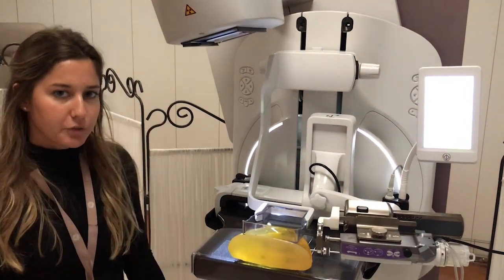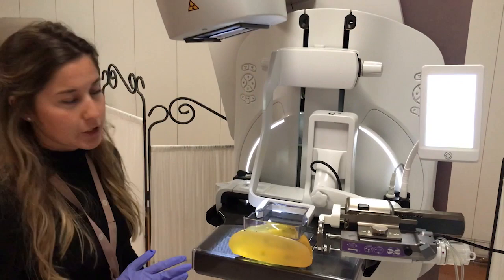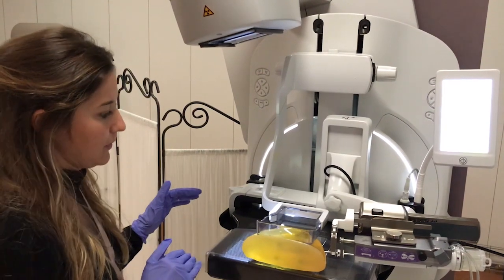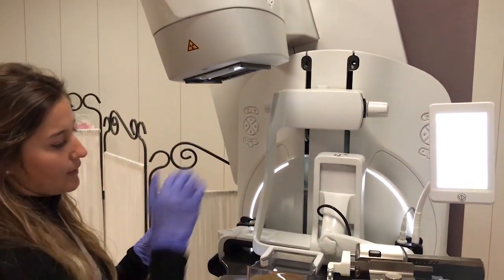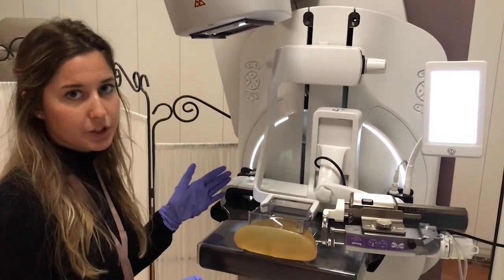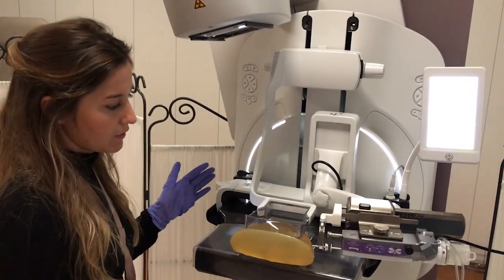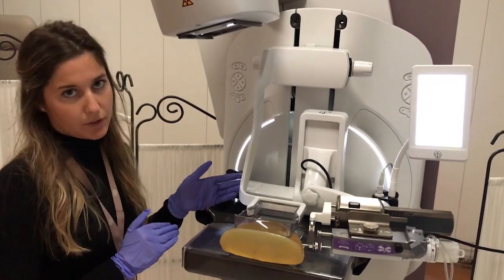I'm going to demonstrate how the Pristina Serena sample imaging works. We've created a solution that's integrated into the biopsy system so that it's simple to use. You need to slide this sample blade here for the exposure. It's also efficient because you can proceed to the sample imaging exposure within three steps, and it's cost effective because you do not need any additional dedicated device for the exposure.